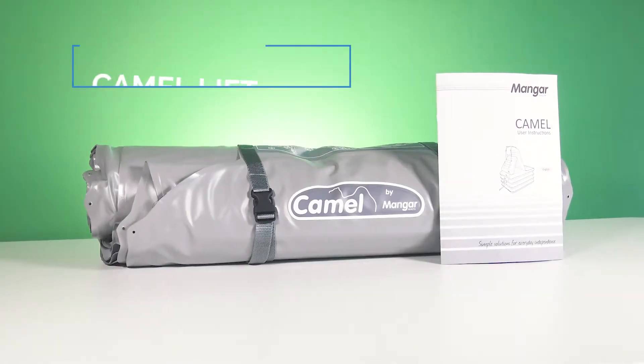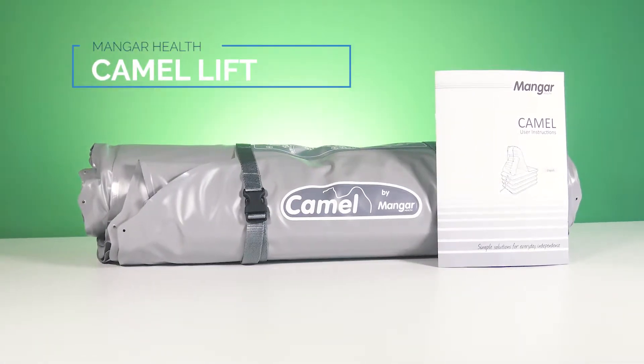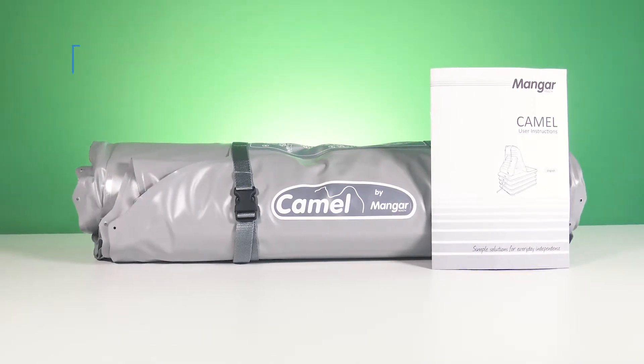The Camel Lifting Cushion from Mangar Health is a unique solution for helping a mobile patient up after a fall. Its pneumatic battery-powered lifting technology allows it to be powerful, portable, and easy to operate.